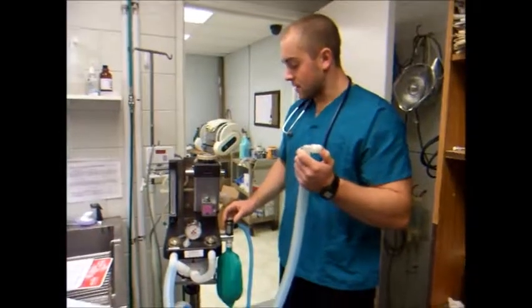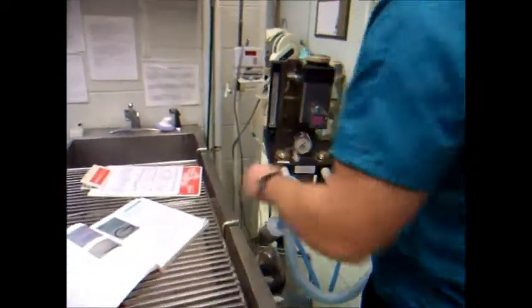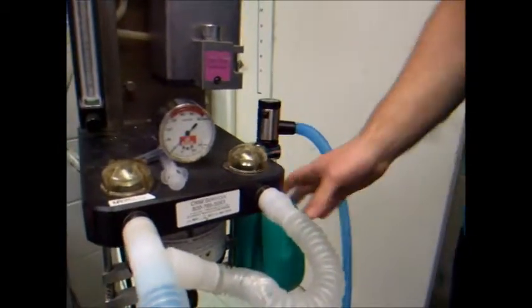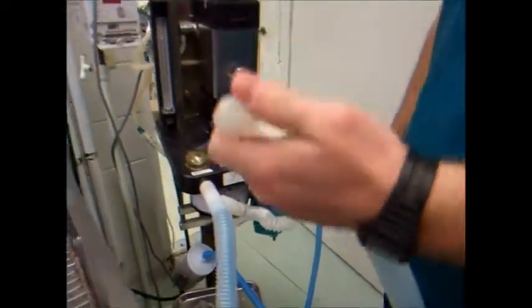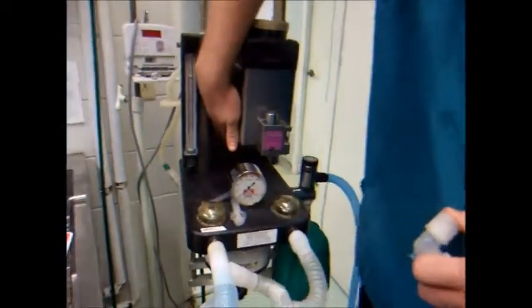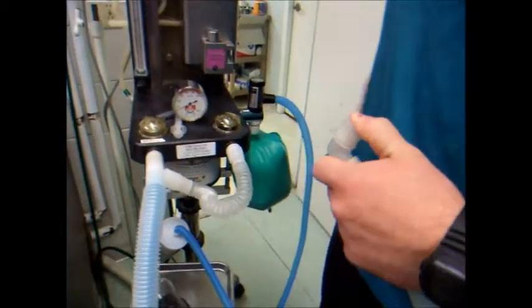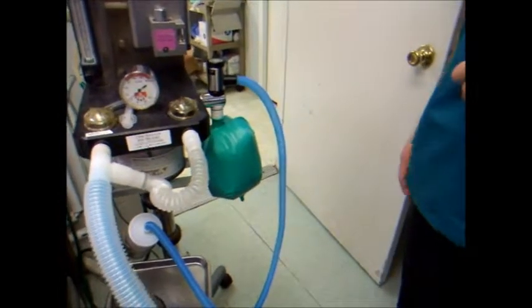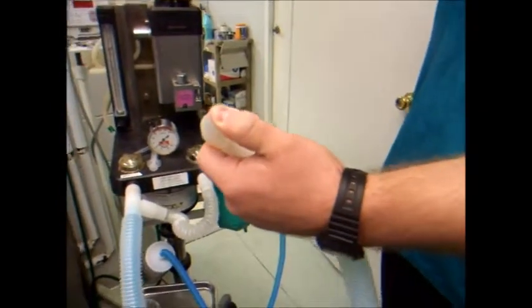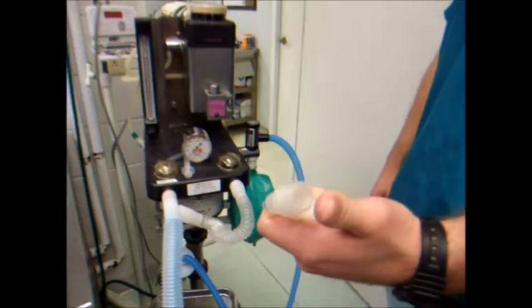I'm going to demonstrate how to do a leak test. So we got to make sure that the pop-off valve is closed all the way. We've got our bag here. I'm going to cover the end of this, and I'm going to hit the flush valve button here until that inflates all the way, and we're going to make sure that nothing leaks out of there. Looks like nothing is coming out until I actually release this, so we don't have any leaks.